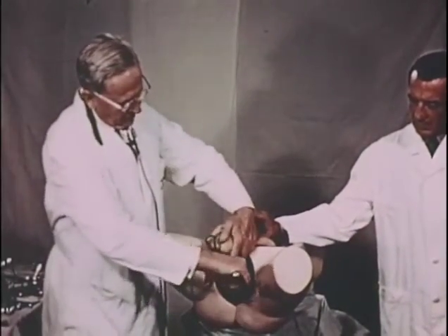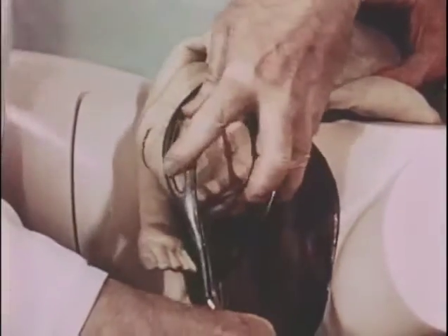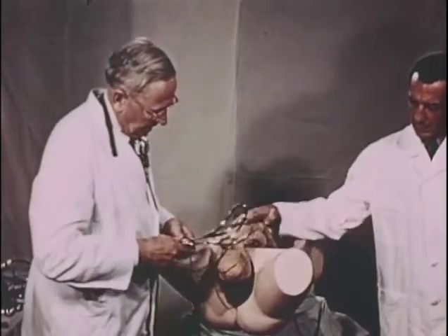Here there's quite a bit of fenestration in advance of the head. And the toes of the blades are right on the top of the malar eminences. Continued traction might result in slipping, which would cause damage to the mother as well as the child.